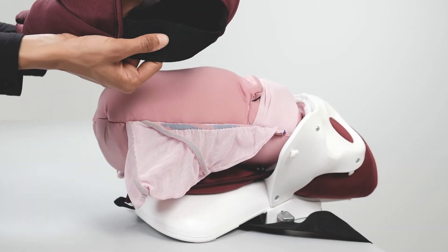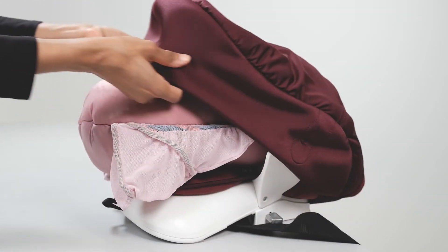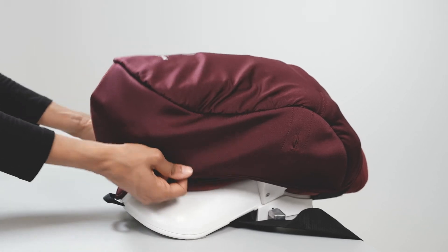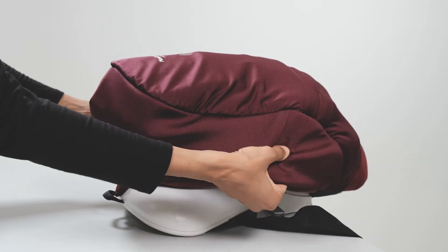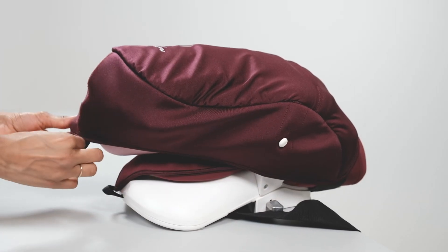Pull the CS abdomen skin over the pelvis and uterus. Then attach the abdomen skin to the pelvis pegs and hook the elastics into place.